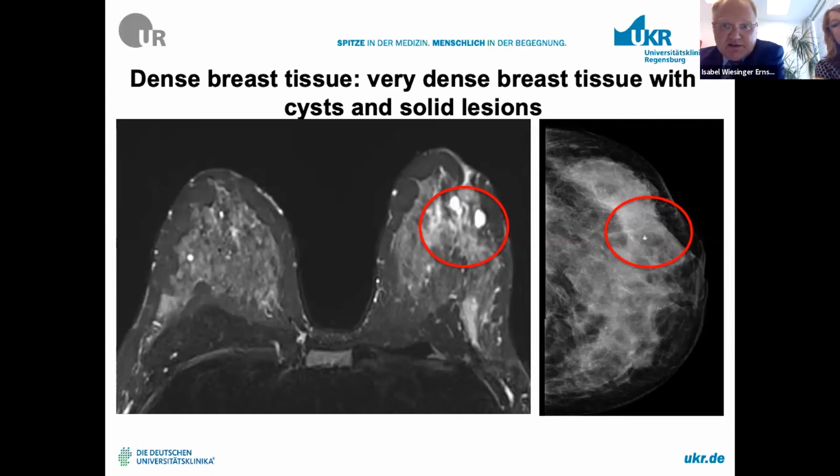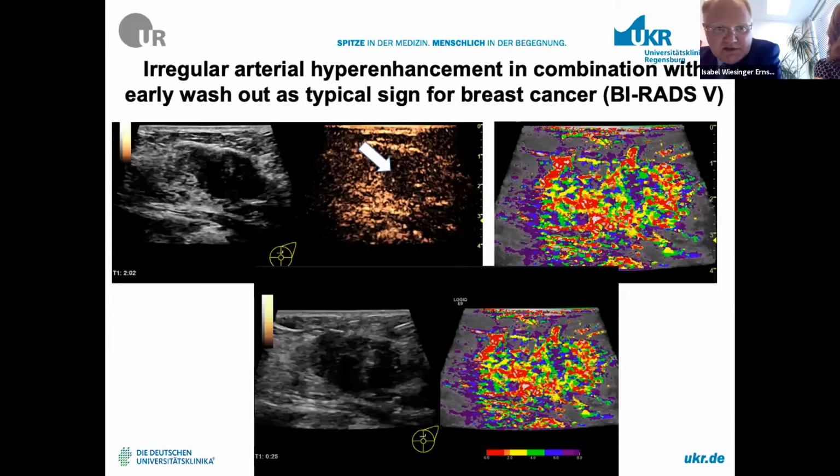So also in this case, no final decision using mammography, but now look at this, the same case. Now you have a clear visualization from parametric imaging of high resolution contrast enhanced ultrasound that the tumor is up to 5 centimeters. And normally, look at this, the size from B mode was at maximum up to 3 centimeters.